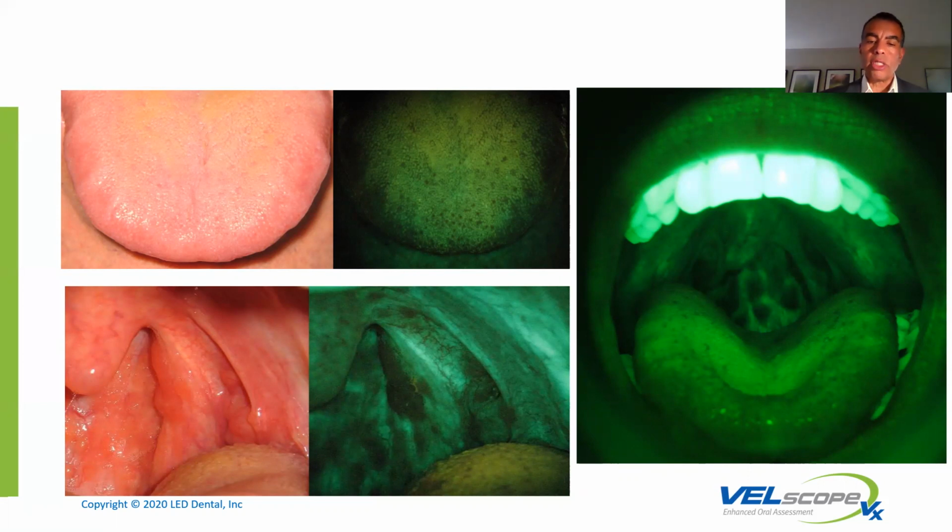But one of the things I want to stress to you, if you really start looking, you start seeing a lot of little black masses all throughout the back. And obviously, if I opened up this picture, you see black masses throughout the back of the throat. So that reduces our concern because, again, we know cancer doesn't grow that way. But it wasn't resolving, so the patient gets referred to an ENT. ENT immediately takes a biopsy. Like, I don't know what this is, but there's something going on. The only way to confirm is biopsy, and it comes back as inflamed lymph node tissue, which is fantastic, meaning it's not cancer, but it wasn't resolving. Patient ends up being diagnosed and tested for severe acid reflux.